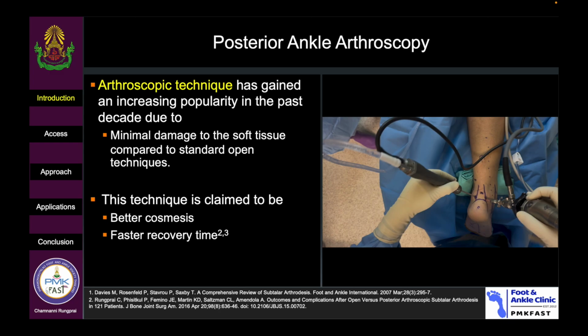Arthroscopic technique has gained increasing popularity in the past decade due to minimal damage to the soft tissue compared to standard open techniques, and this technique is claimed to have better cosmesis and faster recovery time.